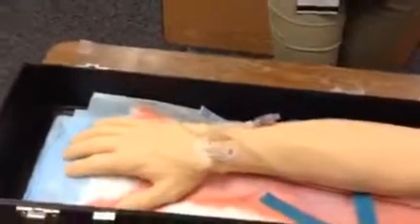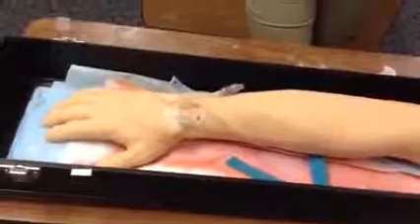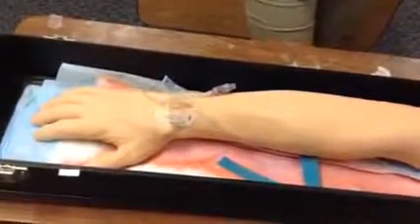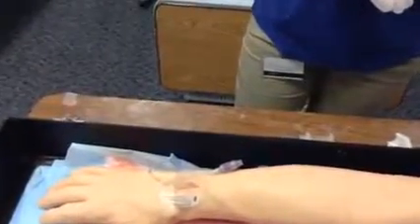Now I would apply an alligator clamp to the tubing for the next administration. I would have to say that the H in ASASH is only used when there's a written order from the doctor for a PICC line flush or a central line dressing.